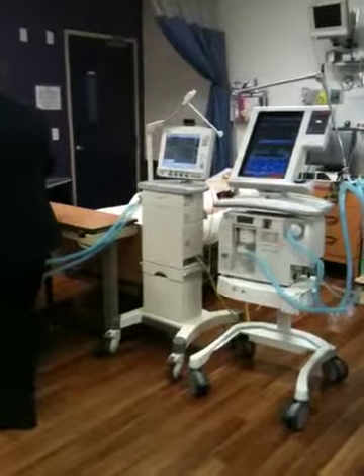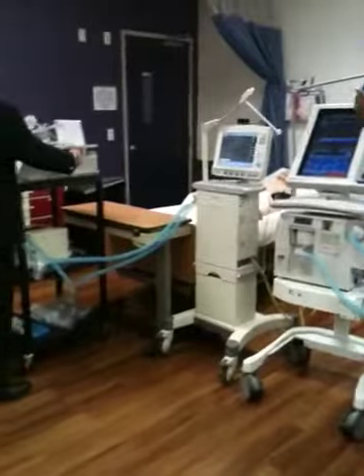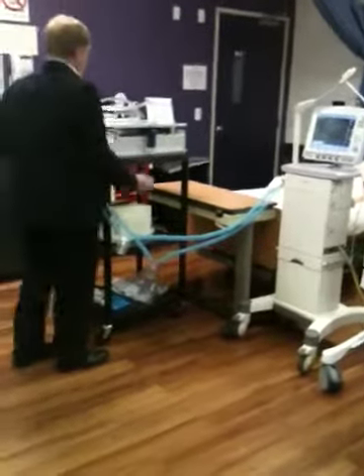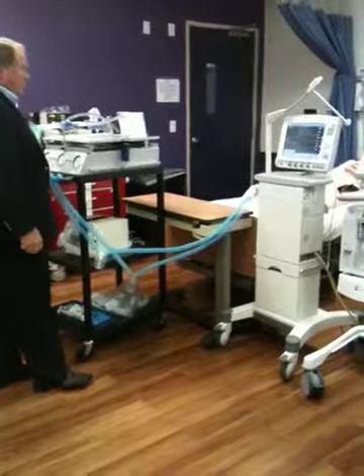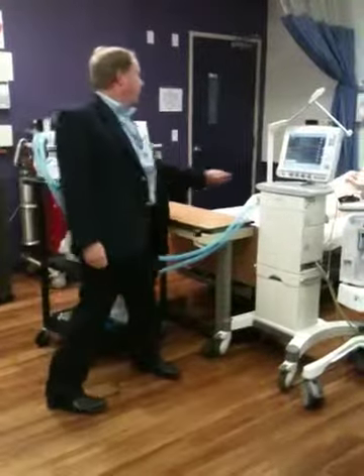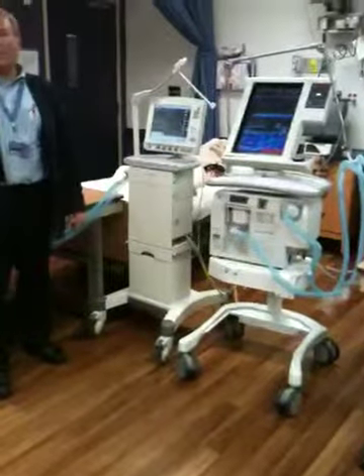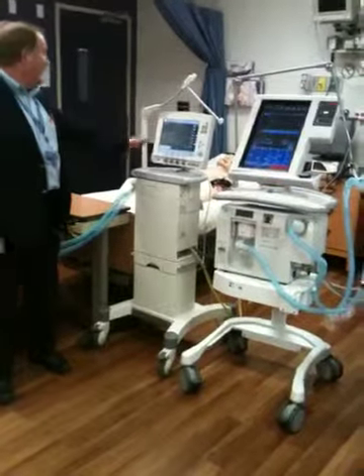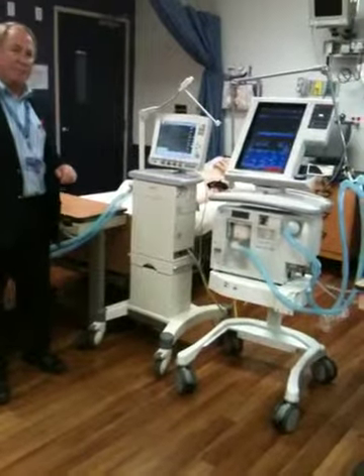If I did something and changes with my patient, now my curve went more upright and my compliance went to 64. So I can look at the graph and say, I know it went up. I look at the numbers and it tells me how much it went up.